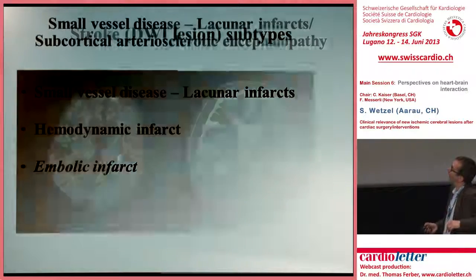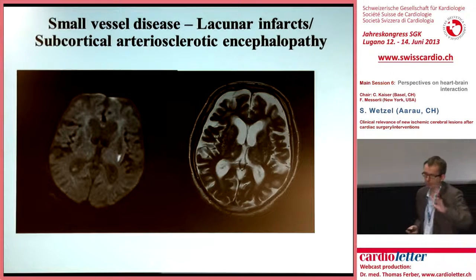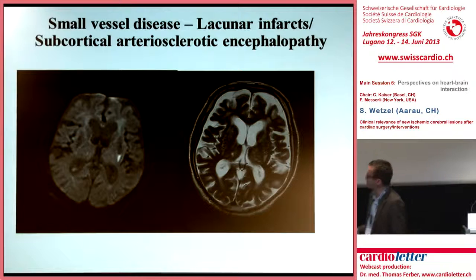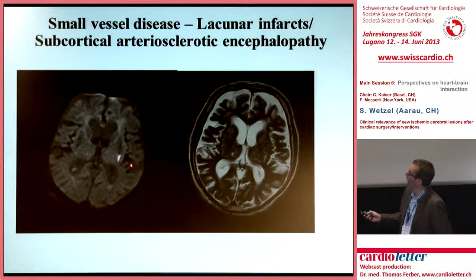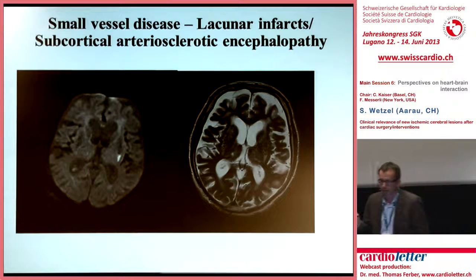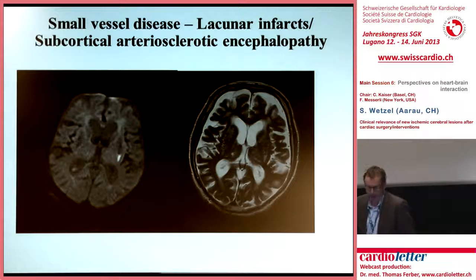The majority of lesions we probably see in the elderly populations are small vessel disease. So these are caused by a disease of the perforating arteries which enter the brain, and at some point they become acute, and they might make new lesions which are visible on DWI images. And that's very nice of DWI nowadays, that in those elderly patients with a lot of lesions, we can distinguish and attribute a new lesion to a clinical syndrome. This was before sometimes not possible.